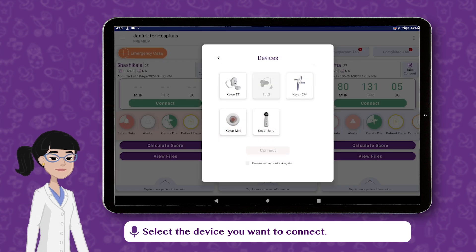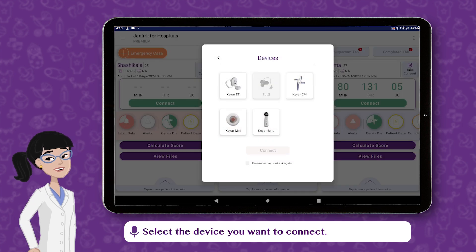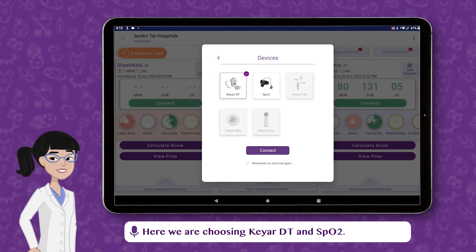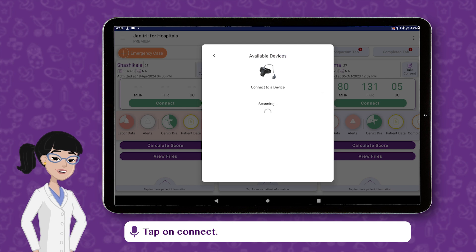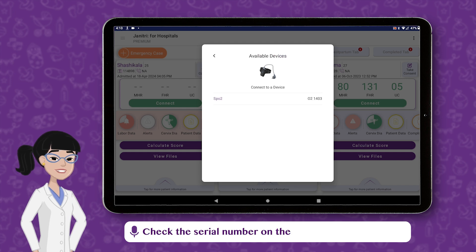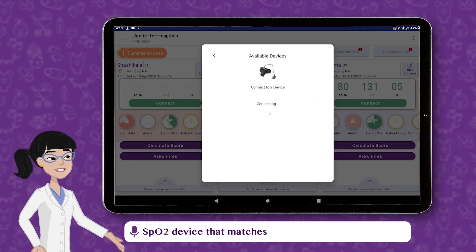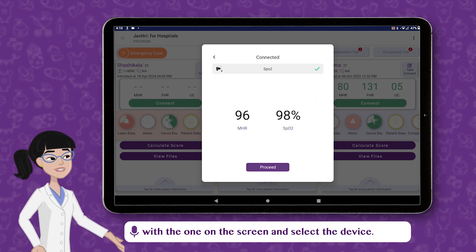Slide down the notification bar and tap the Bluetooth icon to turn it on and connect the devices. Tap on Connect and select the device you want to connect. Here we are choosing Keyar DT and SPO2. Tap on Connect. Check the serial number on the SPO2 device that matches with the one on the screen and select the device.